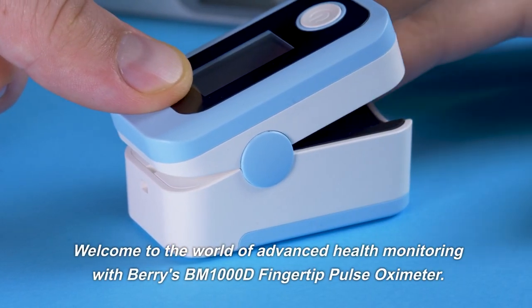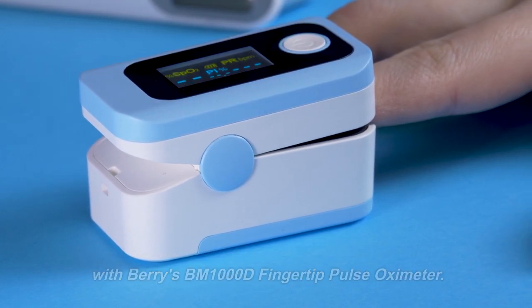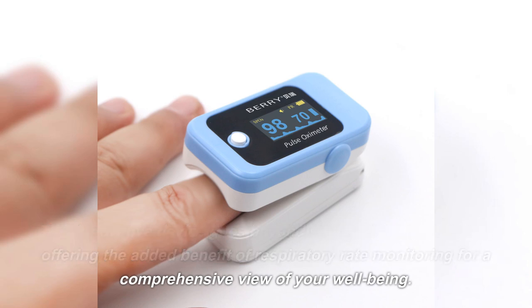Welcome to the world of advanced health monitoring with Barry's BM-1000D fingertip pulse oximeter. This innovative device goes beyond standard measurements, offering the added benefit of respiratory rate monitoring for a comprehensive view of your well-being.